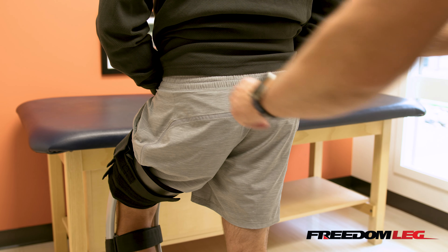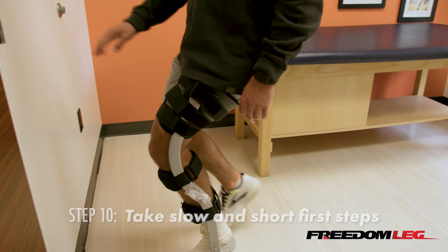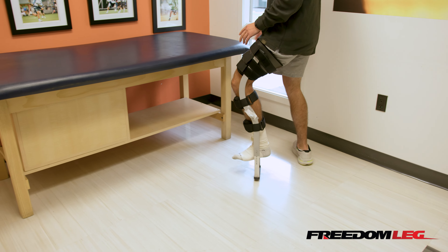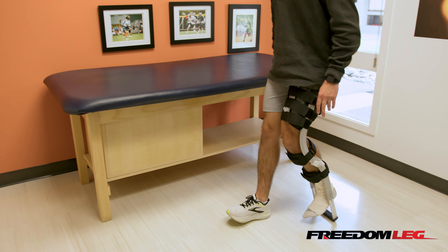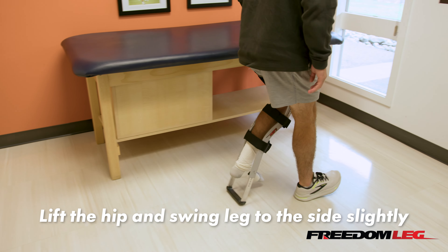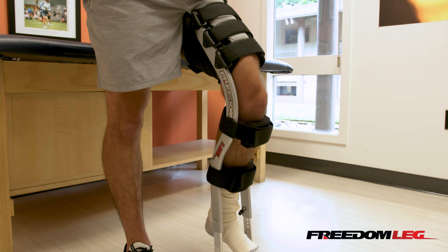When your freedom leg is fit correctly, your hips will be level as you walk. You'll still have to pick your leg up a little bit to swing it through, but you want these hips to be level. Finally, you can take your first steps — they're going to be slow and short. Feel free to hold on to something. Walking with a stick is helpful, or you can walk with crutches or a walker. Your hands are totally free to catch you in case there's a problem, so you can even use the walls to stabilize yourself. Be aware that you'll need to lift the hip and/or swing your leg out to the side slightly. Be careful not to catch the brace on the ground when swinging through. Now you're off to the races — wear your freedom leg out to the yard, the beach, the woods, the shop, or wherever else you want to go.